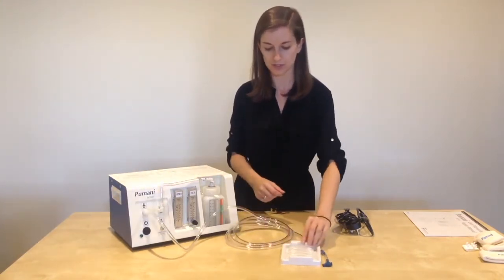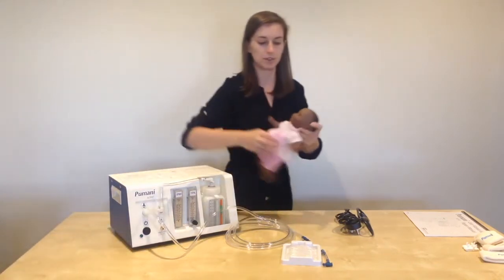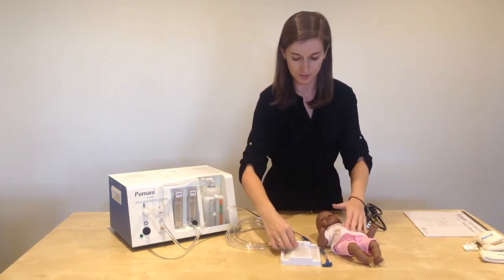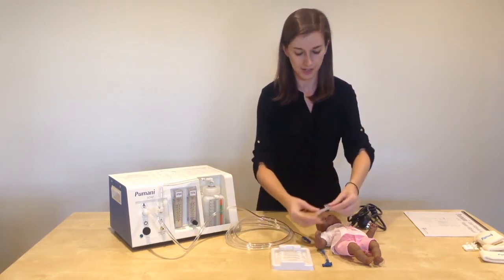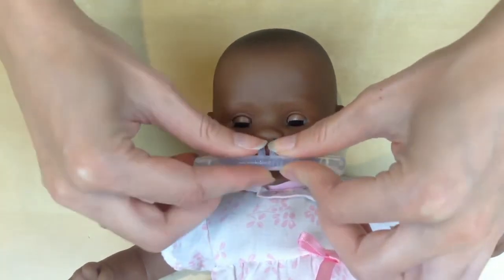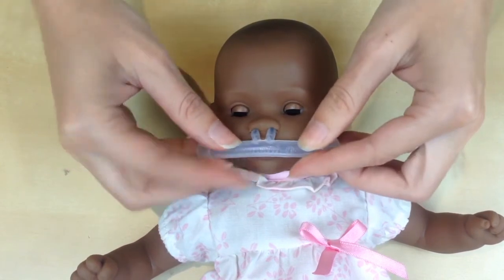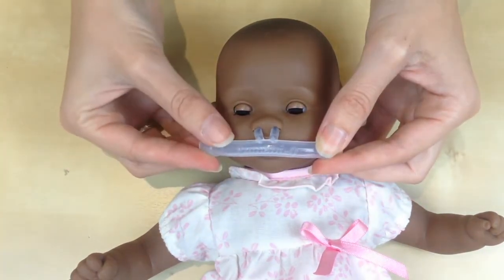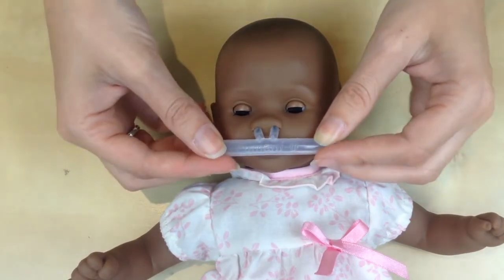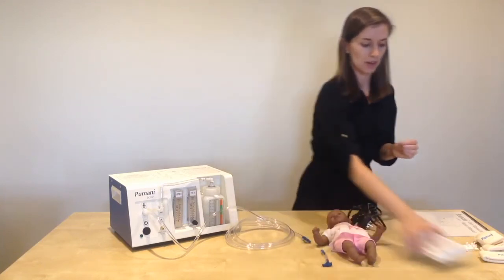Your next step is choosing the prong size that is the best fit for the patient. Typically patients are on oxygen therapy before going on the Pumani, so while the baby is still on oxygen, take one of the nasal prongs and place it in the patient's nostrils very briefly. Make sure that the prongs completely fill the nostrils — that is very important so the patient receives full pressurized air into their airway. Confirm the prongs fully fill the nostrils and are not too small, too large, or irritating. I have chosen size zero for this baby, which is the smallest size.